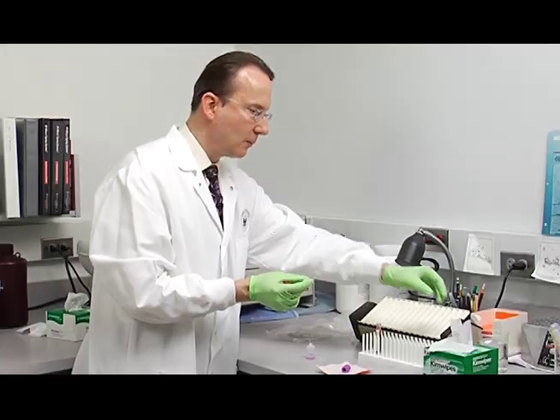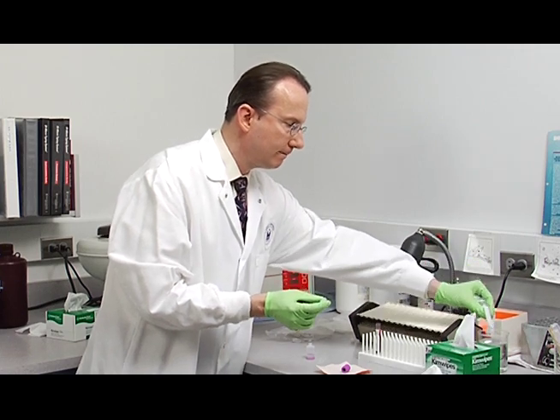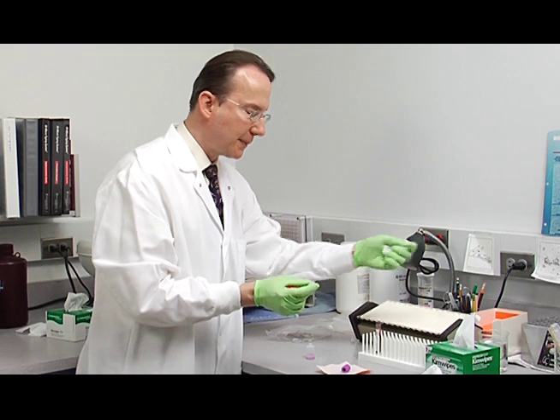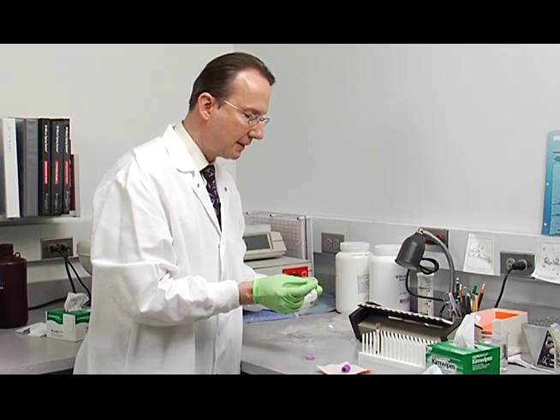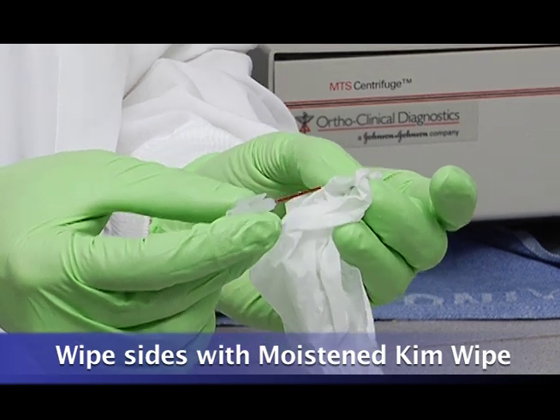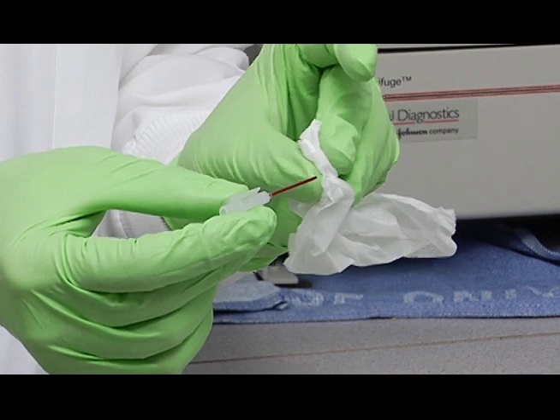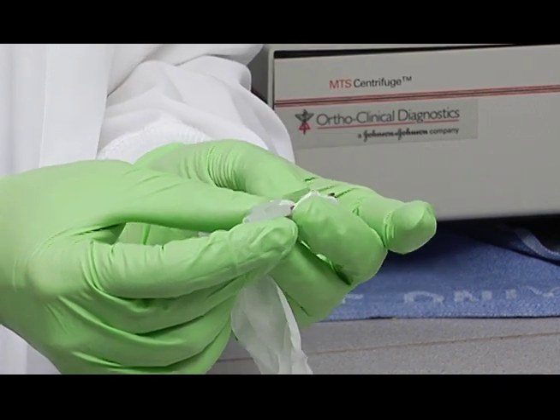Then with a moistened kim wipe, not sopping, just slightly moistened, wipe the blood off the outside of the capillary, just like this. Make sure you don't blot any out the tip this way. So the sides just like this.